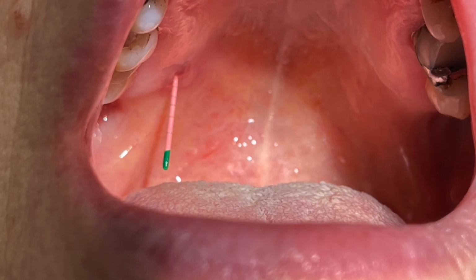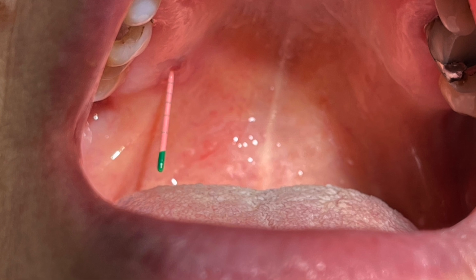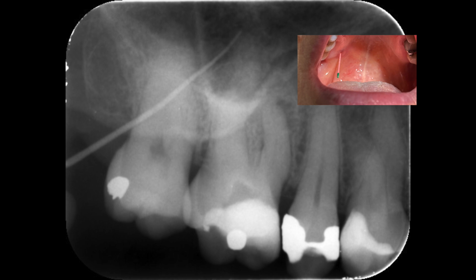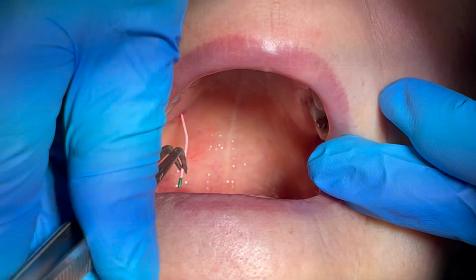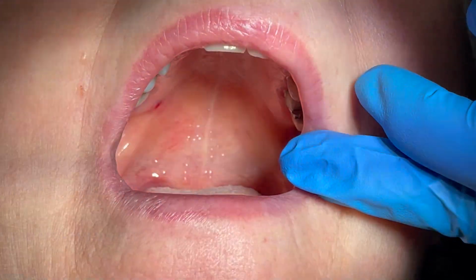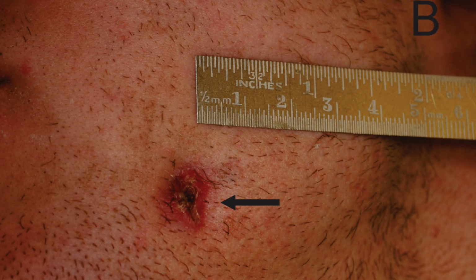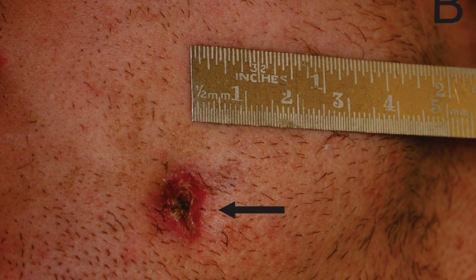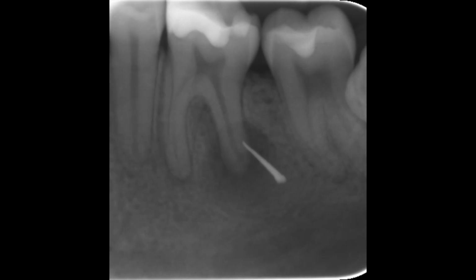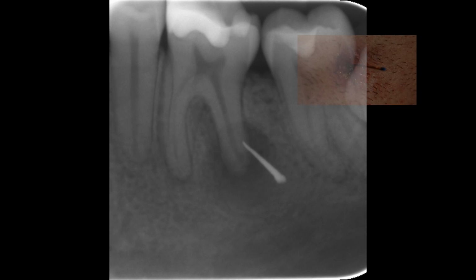Here is a sinus tract located on the palate. The periapical radiograph indicates that the source of infection is the palatal root. After taking the radiograph, remove the gutta percha point and discard it. In rare cases, a sinus tract can appear extraoral. A sinus tract that drains extraorally can also be traced with a gutta percha point. Here is an extraoral sinus tract and a fistulogram tracing the source of the infection to the lower left first molar.